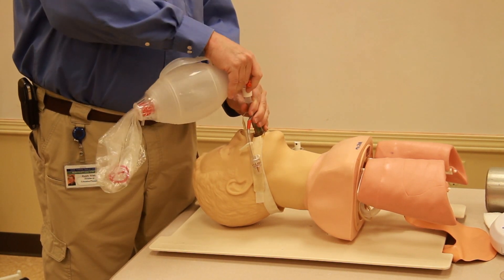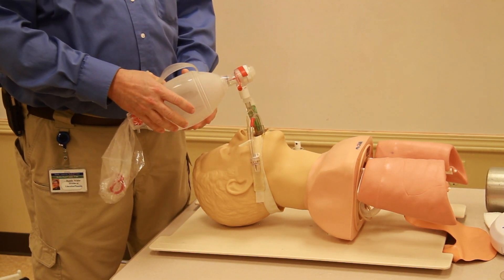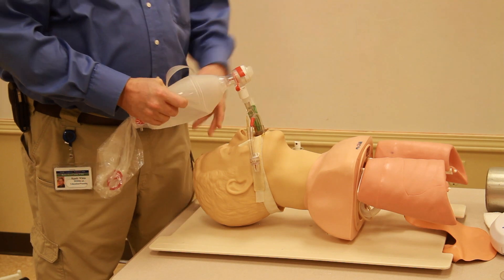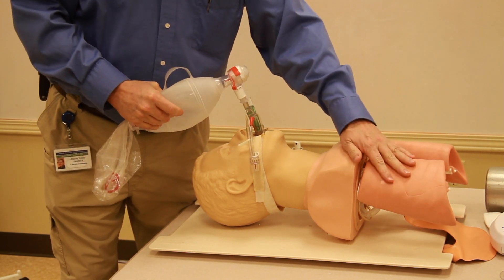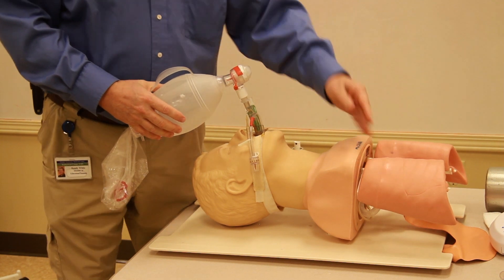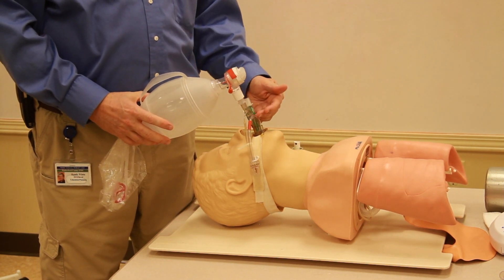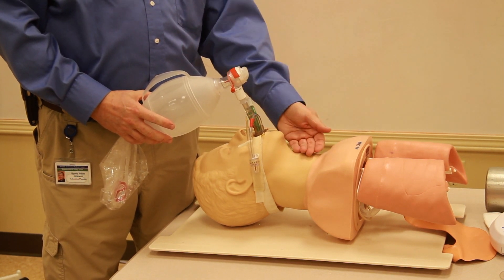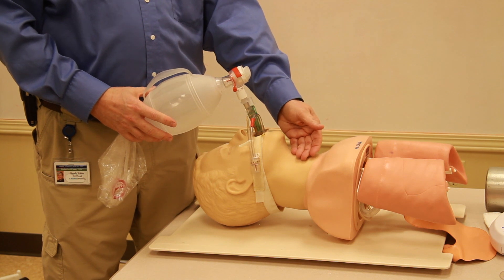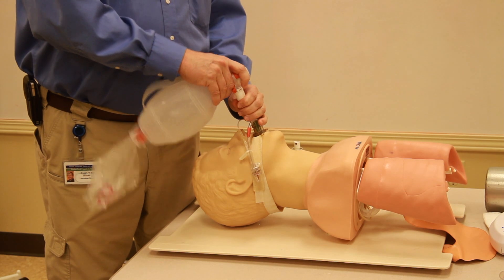If I don't have lung sounds through the colored tube, I remove the stylet and ventilate through the other tube. I listen for stomach sounds and then for breath sounds. If I have breath sounds, the distal end is now in the trachea, meaning we've effectively intubated the patient.